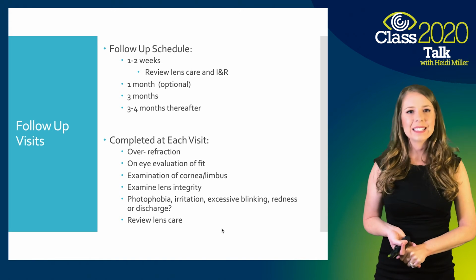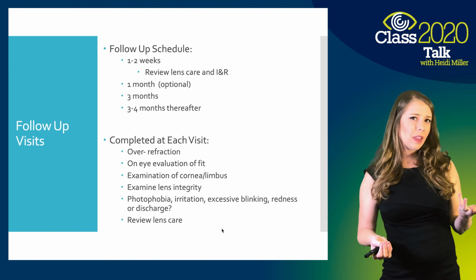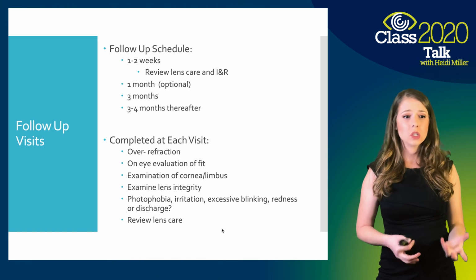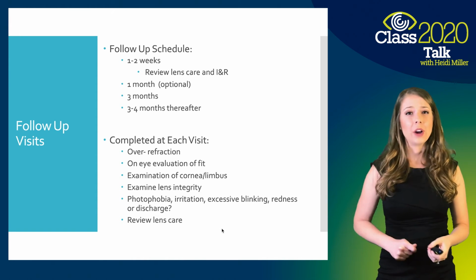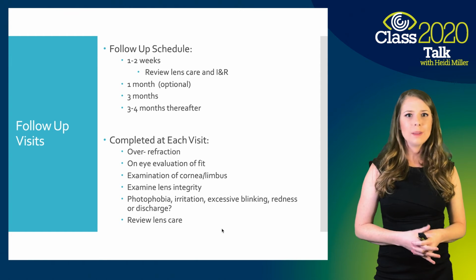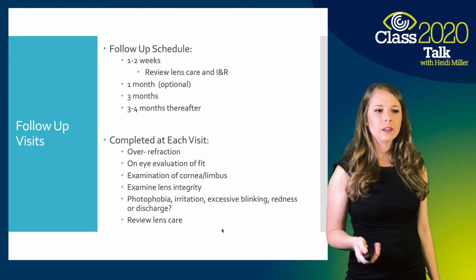And you always want to be asking the parent, are they seeming really light sensitive? Do they rub their eye a lot? Is the eye getting red? Are we seeing mucus discharge? Any habits that are changing with the patient? They're blinking a lot, their eyes watering a lot. These are things that you want to ask at each visit too, just to make sure that there's nothing going wrong. And then again, like I said, reviewing that lens care.